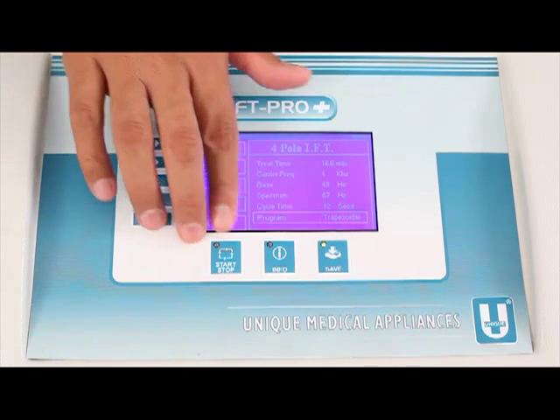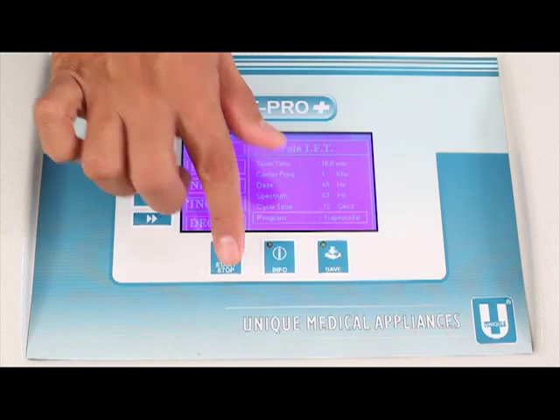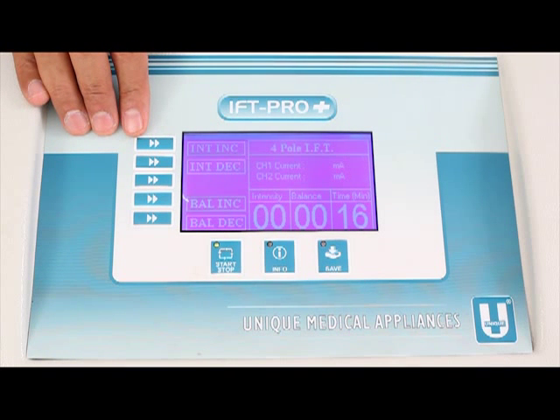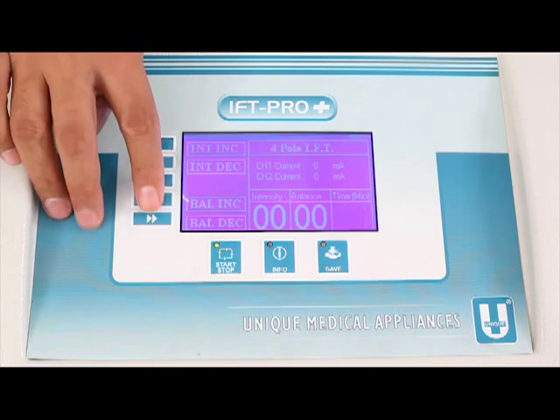Now we can start the program using the start switch, which is the first in the horizontal row. Pressing it announces: 'Treatment started.' The submenu then announces: F1 Increase intensity, F2 Decrease intensity, F4 Balance increase, F5 Balance decrease. It also announces Intensity zero, Balance zero, and Time 16 minutes. You can increase intensity using F1 and F2, and change balance using F4 and F5.